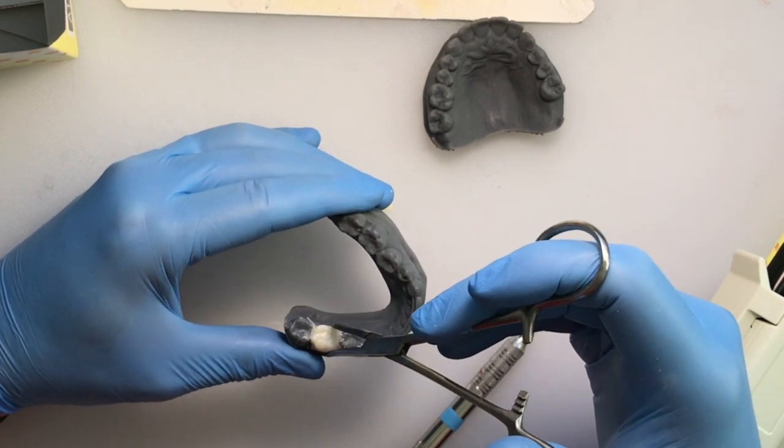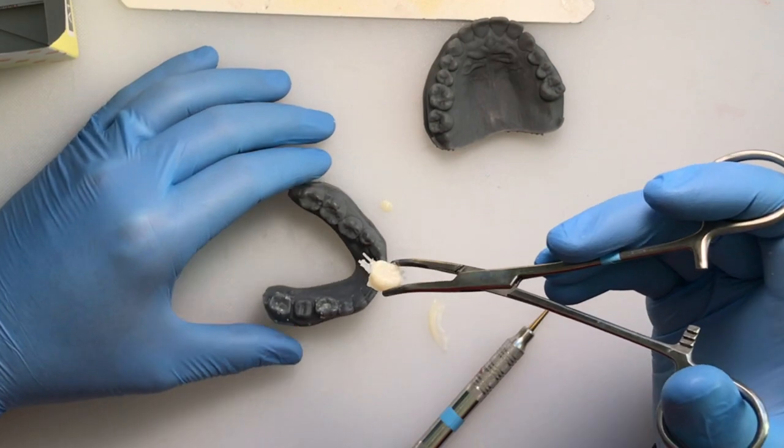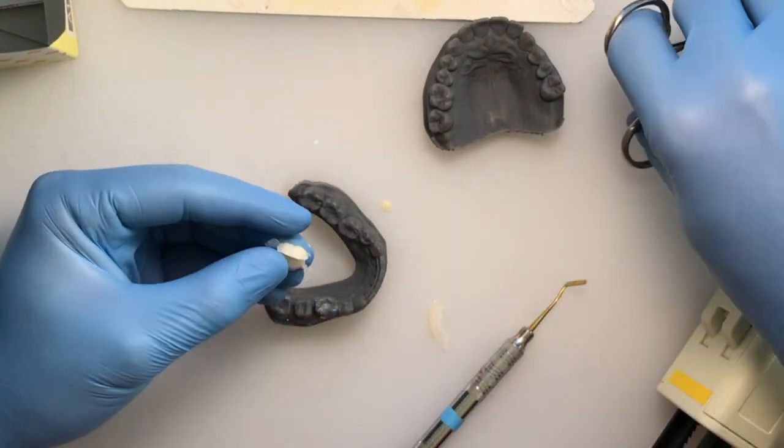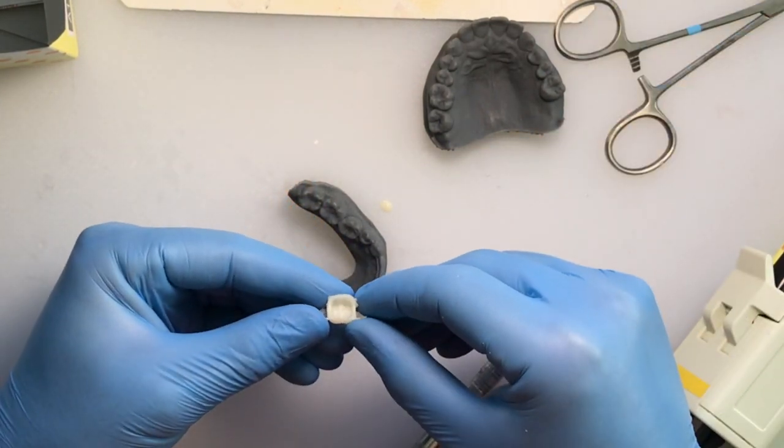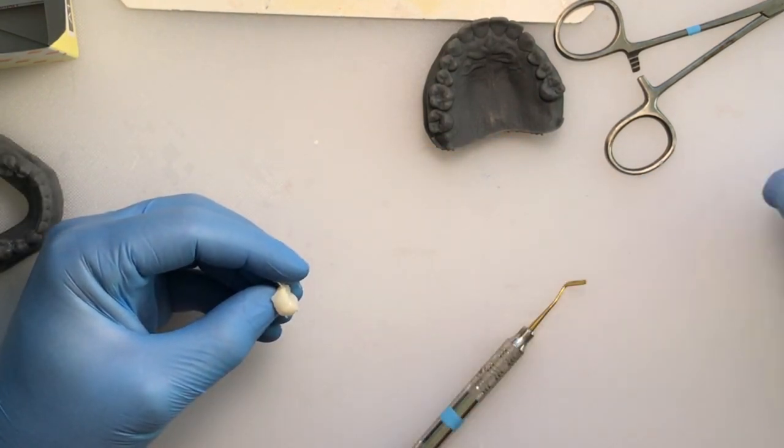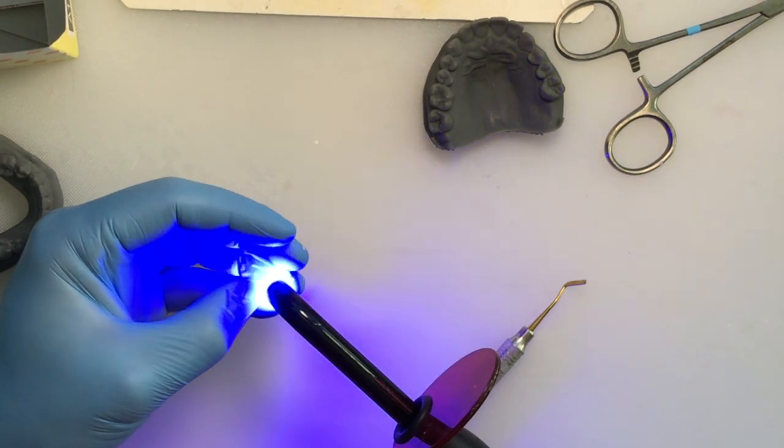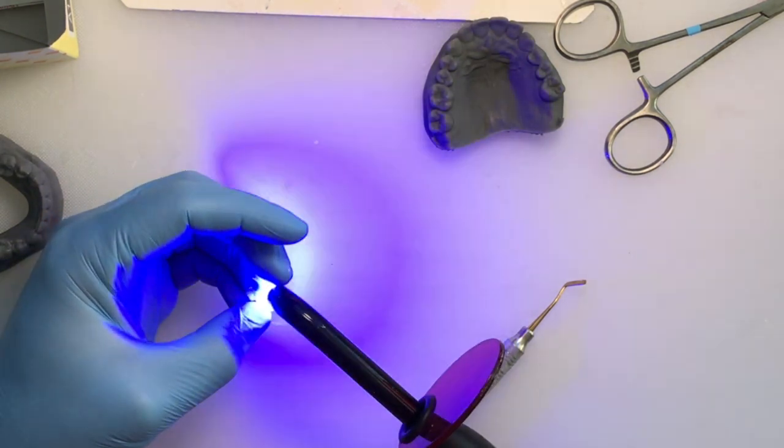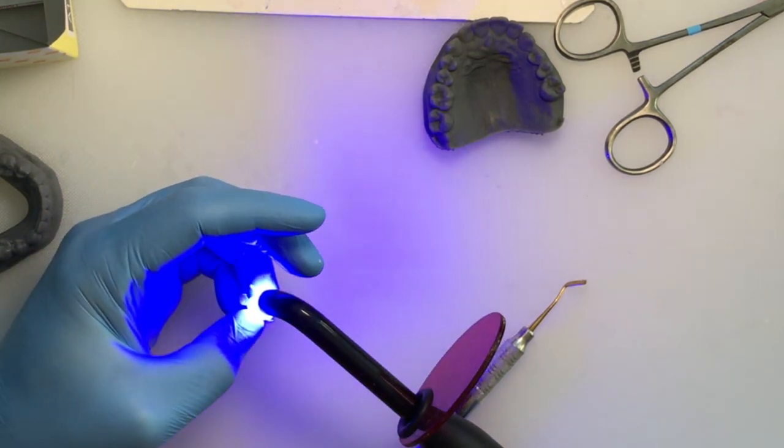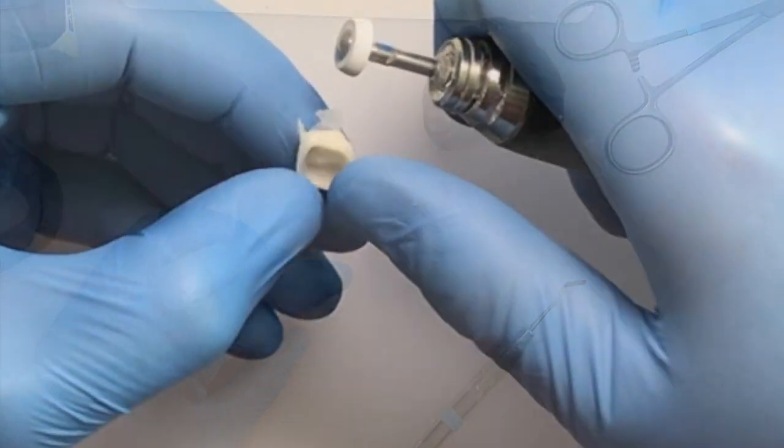Some people use a Moore sandpaper disc. I like a silicone, an aluminosilicate wheel in a lab handpiece. It gives me great control. Again, you can cure it just to make sure everything is set and ready to go.